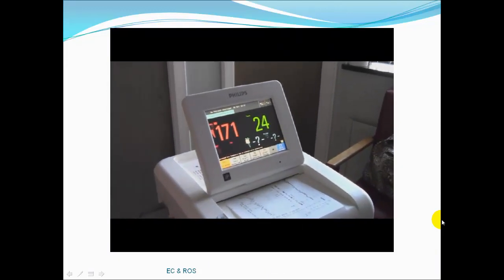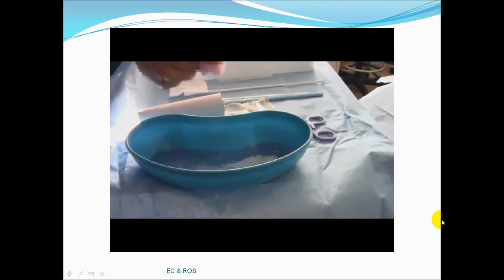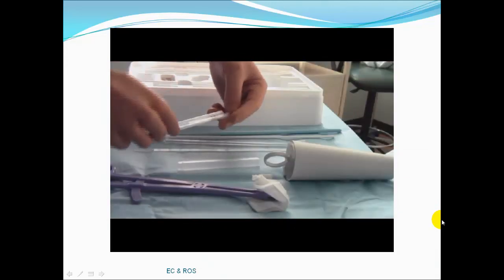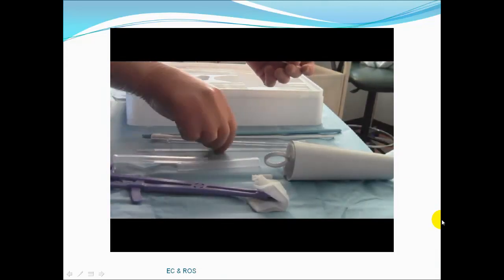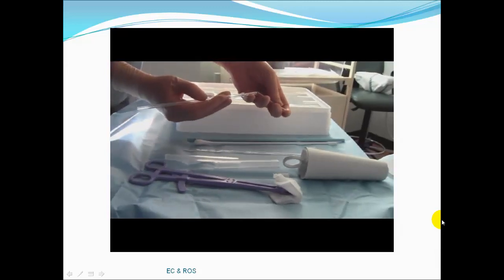Clean and drape the area again prior to the procedure. Now, once you've cleaned the area, ensure your kit is ready. Attach a capillary tube to its holder and have the kit within arm's reach of you for when you are commencing the procedure.